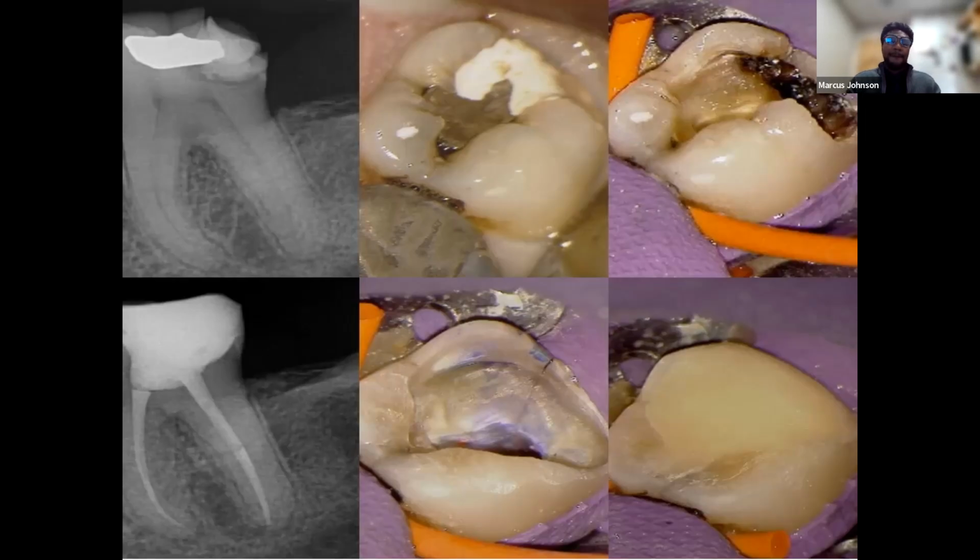Here's a case of a cracked tooth, okay? And I wish I had a little bit more follow-ups on some of these cases. These are cases that I just recently did, so I just wanted to put them in just so you can see that I'm, day-to-day, practicing what I preach. So no distal occlusion, patient over time developed a crack. You can see here, this would be classified as no value, old restorative material, temporary material, even this right here, that occlusal enamel. You can see the decay there.